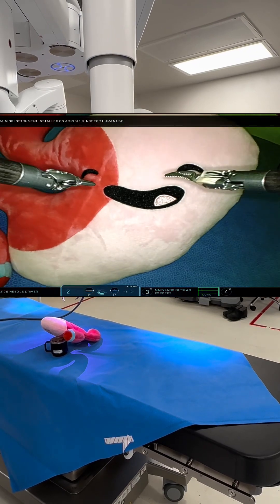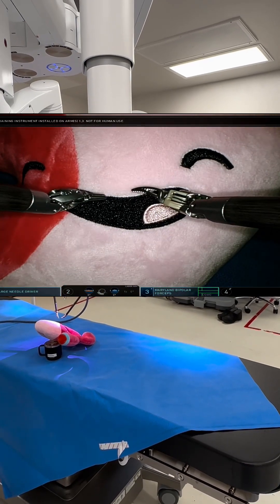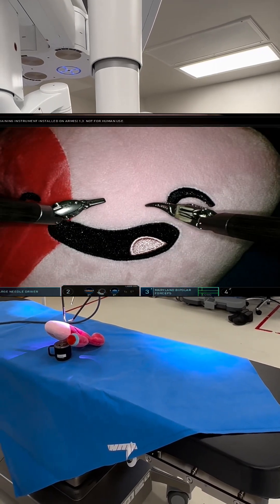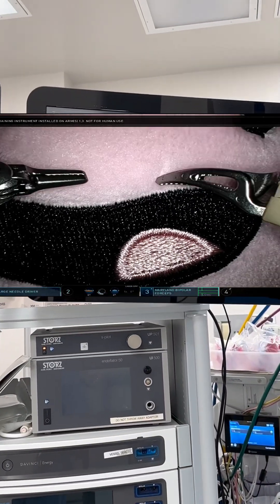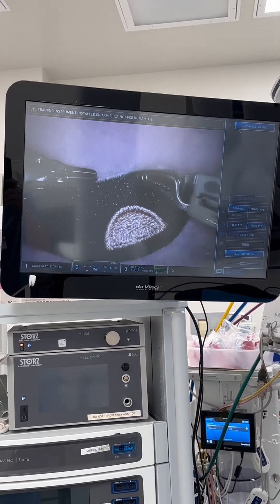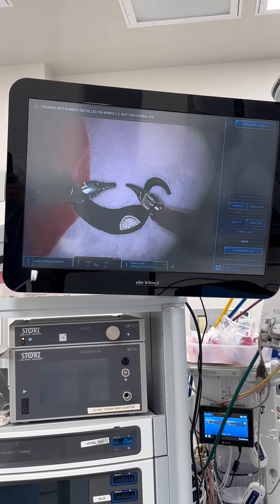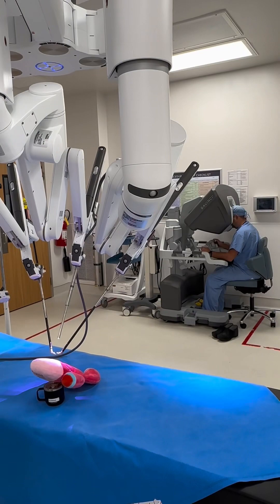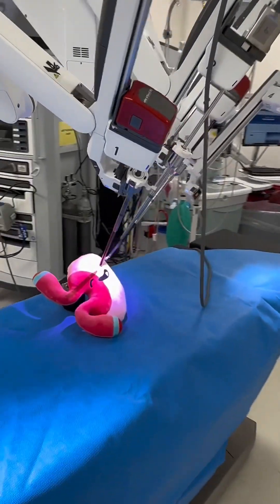Now I'm actually controlling the robot, and I have an amazing three-dimensional view. I can do things that would be very hard to do with normal vision — I can see very, very close, and the amount of detail is really amazing. This allows me to damage a lot less tissue when doing surgery and allows me to do a better job. I think it helps patients recover quicker and makes me an even better surgeon, because this is an extension of my skills — and it's a pretty amazing tool.